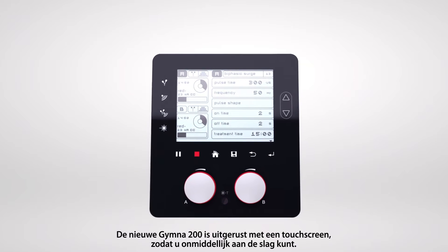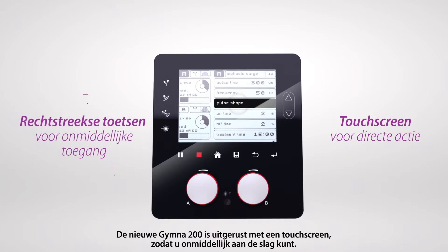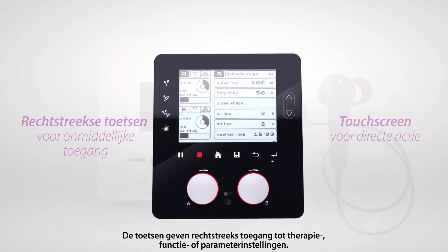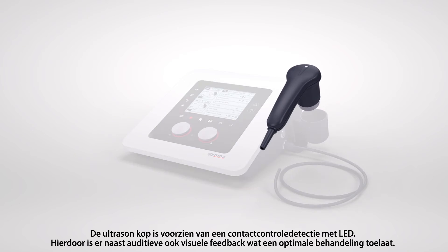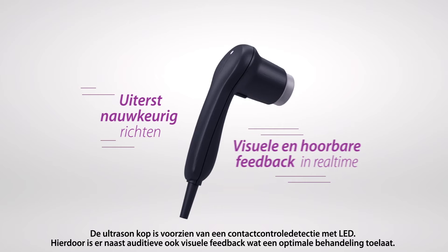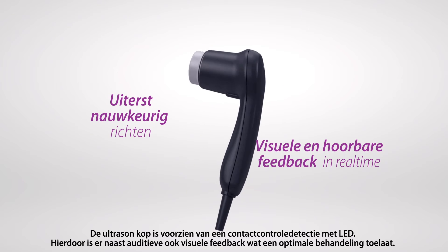The new GYMNA is equipped with a touch screen that provides instant action. The direct keys at the side give immediate access to therapy, function, or parameter settings. The ultrasound head was redesigned to guarantee high-precision targeting. Visual and audio real-time feedback help to reach the treatment zone easily.